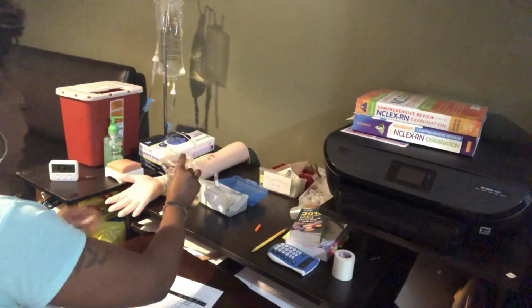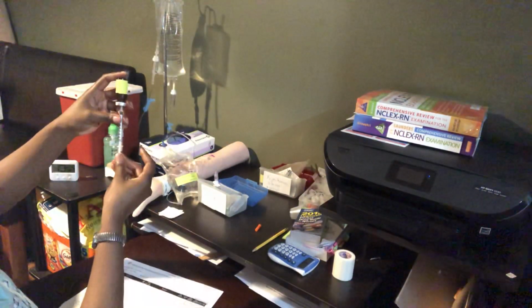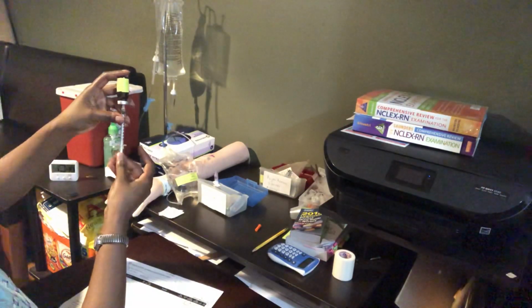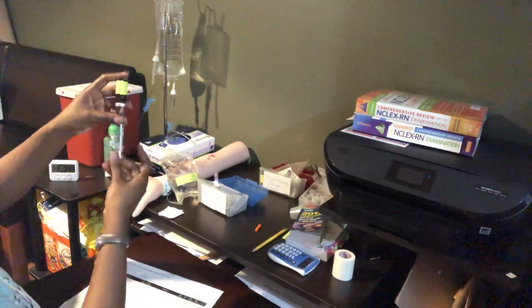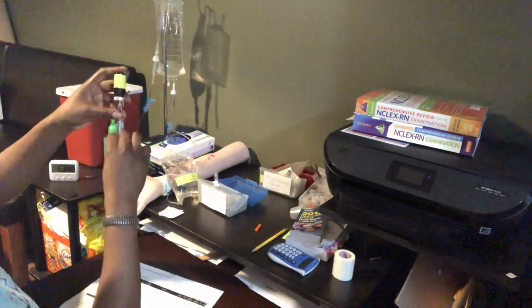Boop. Air. Get 10 units out. Be careful not to touch the hose. No. 10 units at. There it is, 10 units. Put a little extra in there. Guess I gotta get some bubbles out.